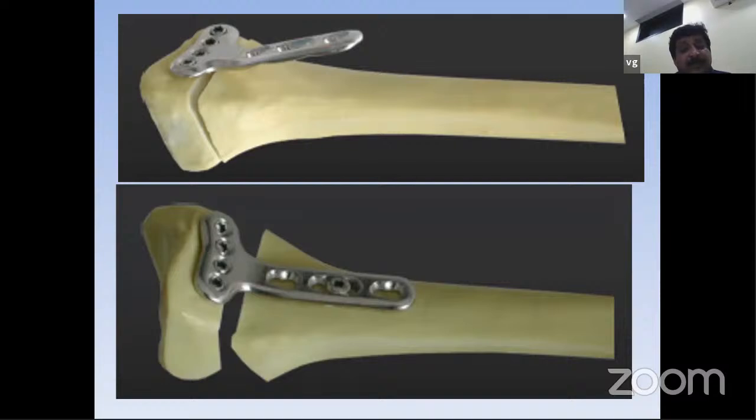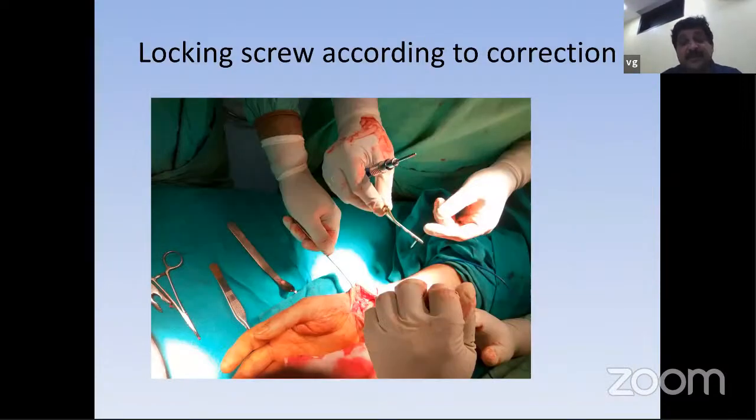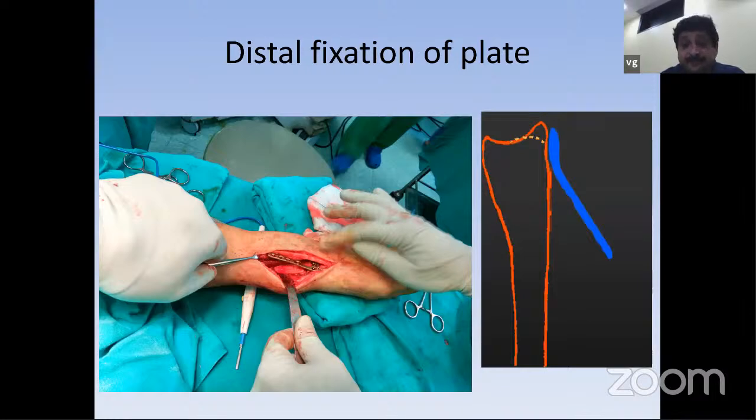Once you put the plate back, you fix the plate distally on the fragment, and once you put a non-locking screw in the shaft, the osteotomy opens up on the dorsal aspect, something like this. This is showing our same patient, in which we had done an ulnar resection. Now we have used the screw, measured the height of the triangle, and you fix it distal in the osteotomy. You fix it on the distal fragment.